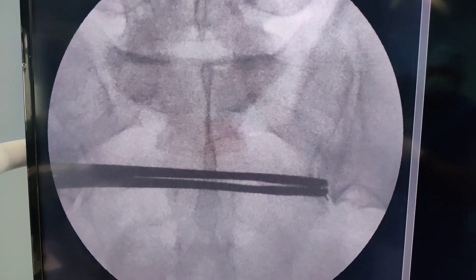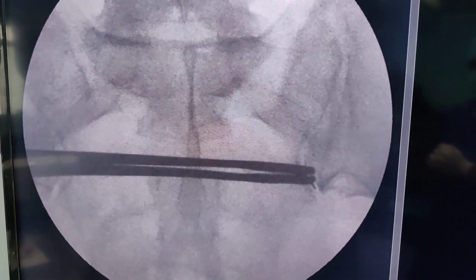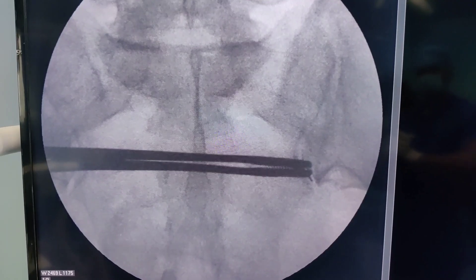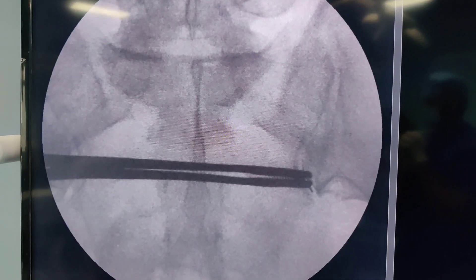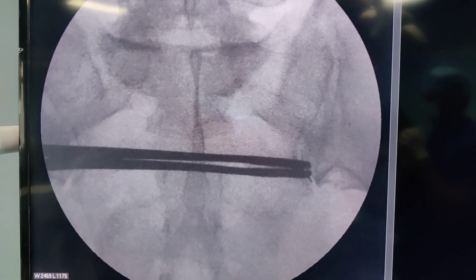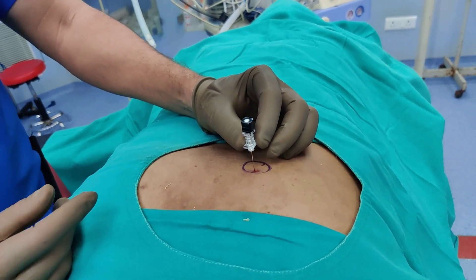Looking at the C-arm images, you can see our needle is in the inferior aspect of the joint and is pretty central. Ideally it should be close to the medial wall, but I am happy with this position. I am going to proceed in the same direction until I feel a give-way sensation of entering the joint.